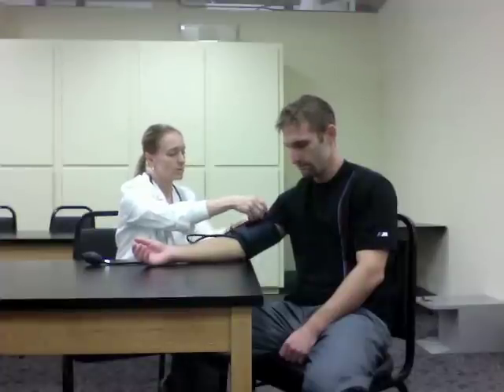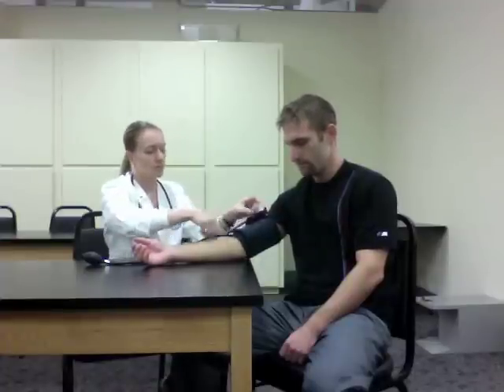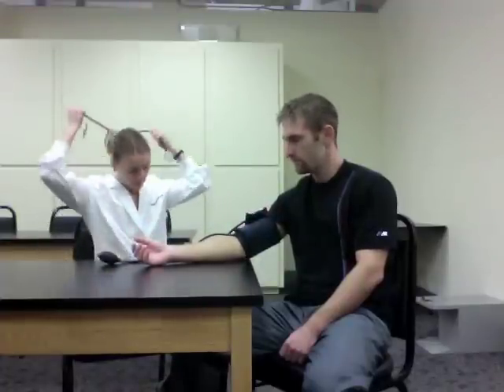The observer should perform the test in a quiet, calm environment so as not to be distracted and so all Korotkoff sounds are heard clearly. The observer should have a pen and paper nearby to record data and both hands available so one can hold the inflation bulb and the other can hold the stethoscope. If an aneroid manometer is used, it is often attached to the cuff in view of the observer.